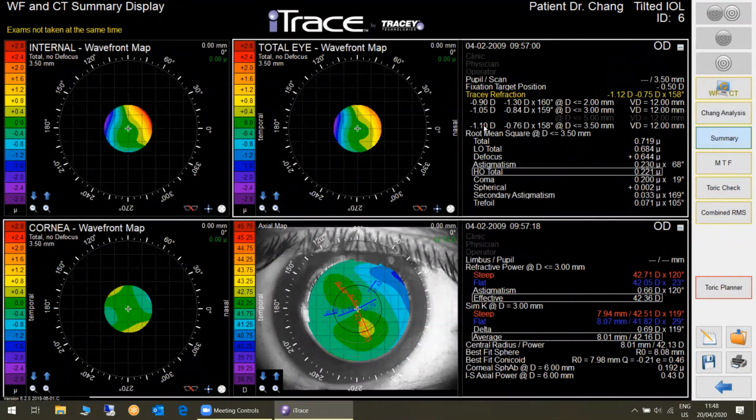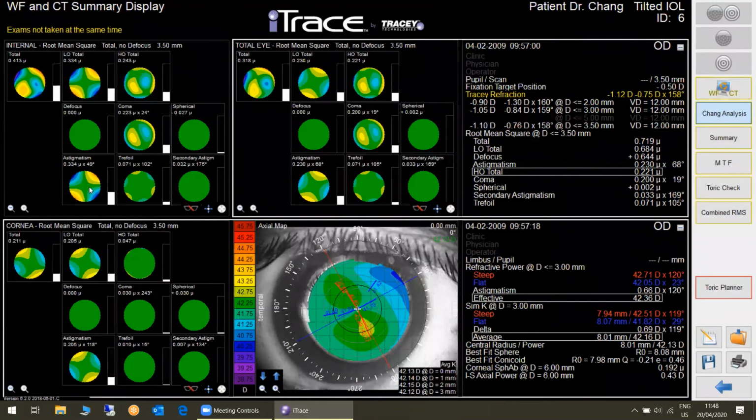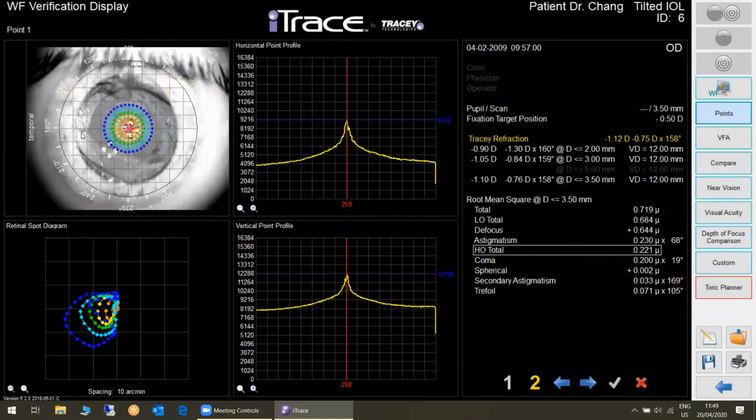It comes from the lens, and the tilt comes here, and it will cause an astigmatism. All tilted lenses will cause an astigmatism. See here, and if you look at the image, you can see here that the haptic came out. So this is how a tilted lens will look like.